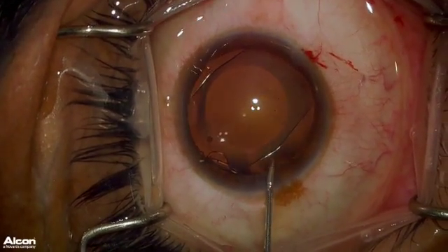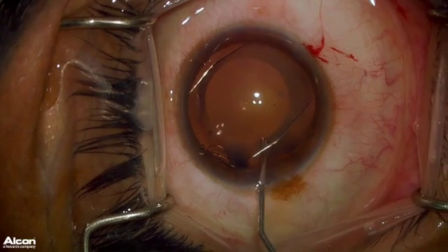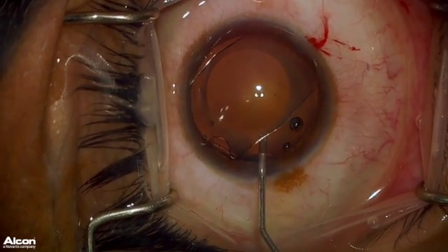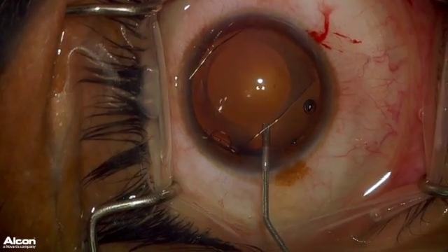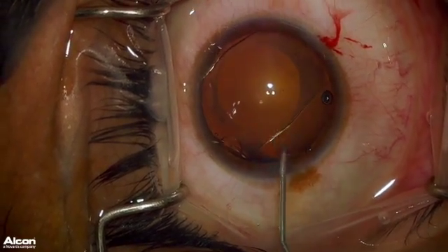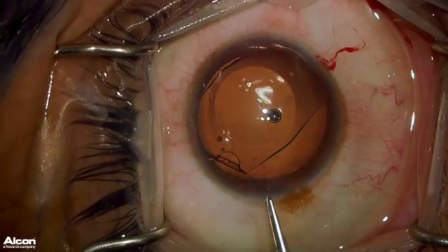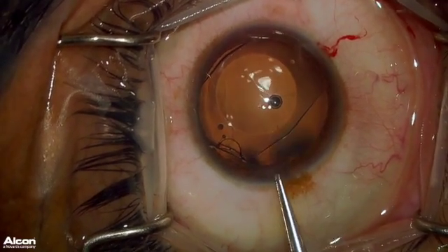Here, I am injecting OcciCote under the ICL to create space between the ICL and the crystalline lens, but I do not want to add too much to where the ICL is pushed up against the cornea and the endothelium. Here, I am showing the planned trajectory of where I want to grab the ICL along the 1/3, 2/3 junction.